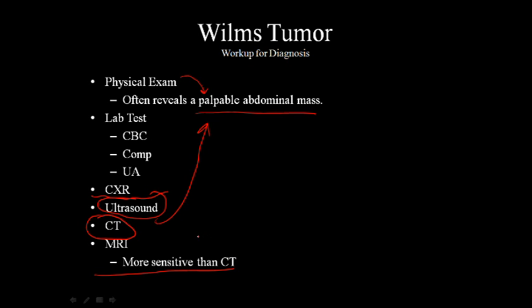However, the thing that you have to keep in mind when performing the MRI is the length of time while the patient is going to be in the MRI suite. And so if you're going to have the patient in there, and consider you're doing the examination on children, children will not stay still for a large amount of time. So that's something that has to be considered.